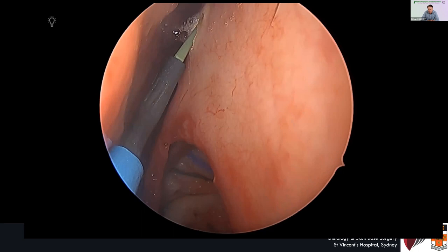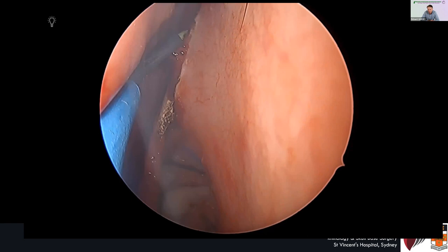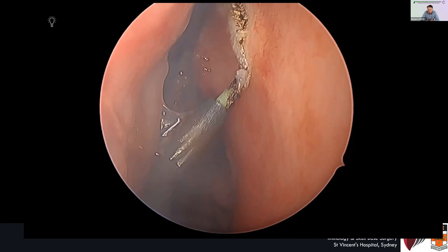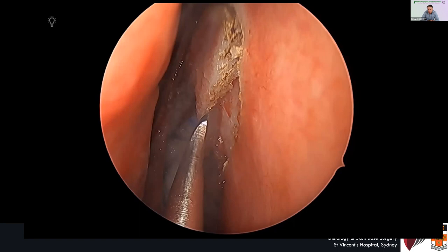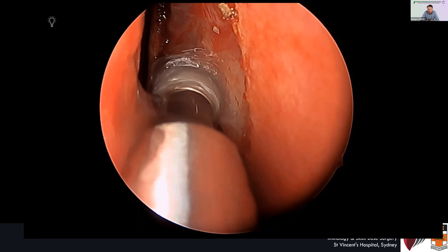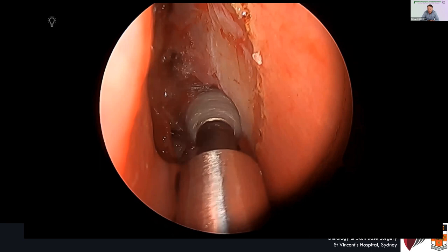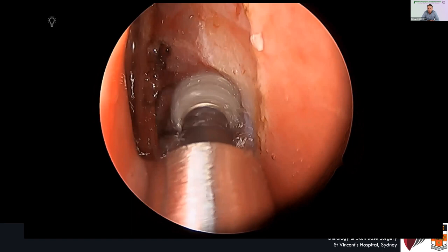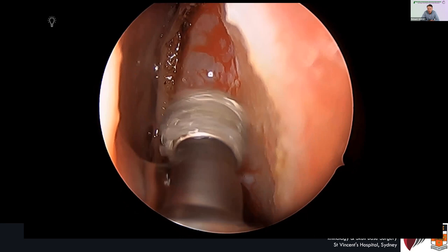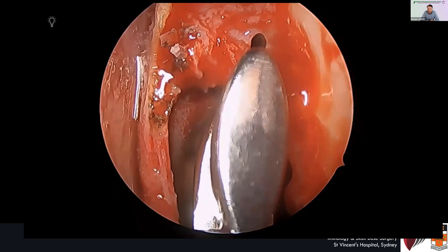This is not how we do it now. This was one of the very first cases where a gentleman had a very large osteoma of the orbit — we'd left him without a great result from the tumor, but he had a bit of frontal sinus dysfunction. So we came back to get access to the frontal sinus. When I looked at his anatomy, I said we just need to remove this little block of bone. Early on, we simply scored off the mucosa with a diathermy, removed the mucosa, and then drilled the bone away. This bone is in front of the agger nasi and then becomes part of the nasofrontal beak.